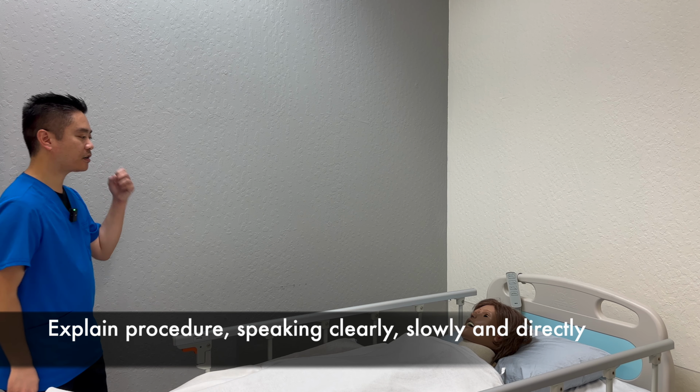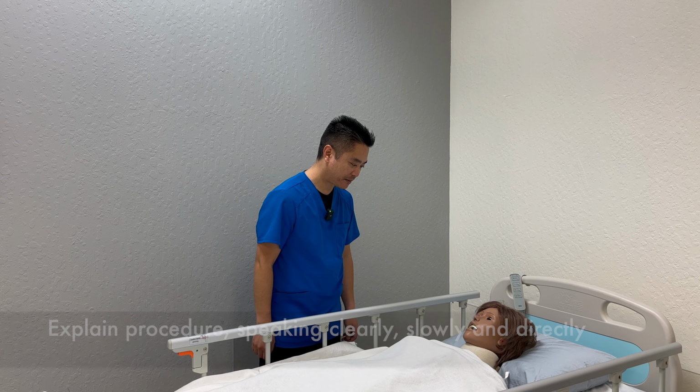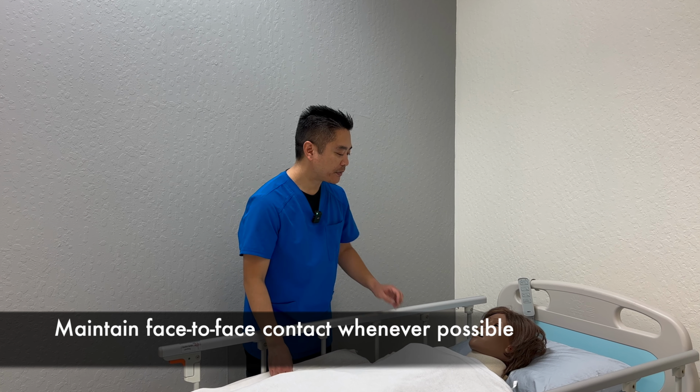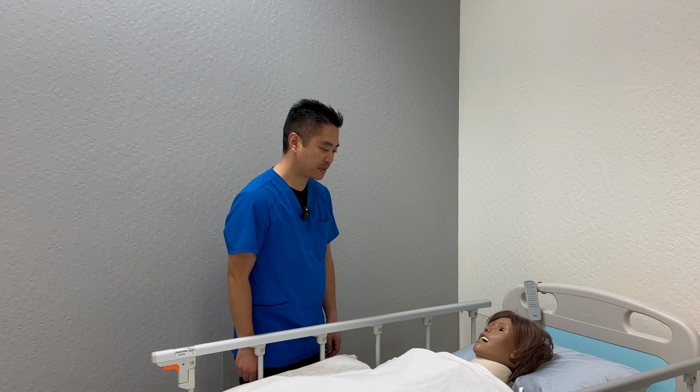Wash hands, knock knock. Good morning, my name is Xavier. I'll be your CNA for today. Is it okay if I check your name, Ben? Mrs. Smith, nice to meet you. How would you like to be addressed? Mrs. Smith? So I'm going to help you today with your catheter care. Is that okay? Alright, so I'll be back with the supplies.